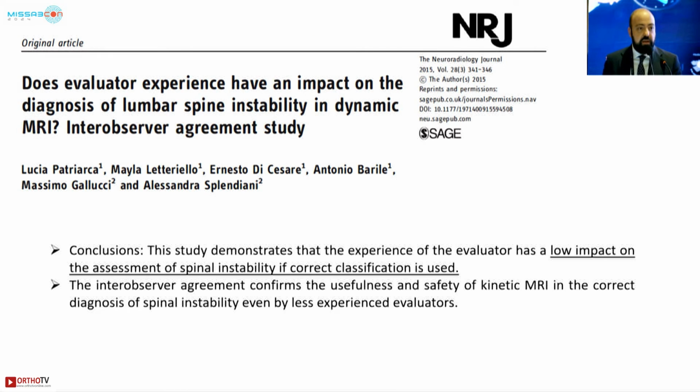All these changes can be visualized both by experienced and less experienced readers with weight-bearing MRI, as we demonstrated in these studies.